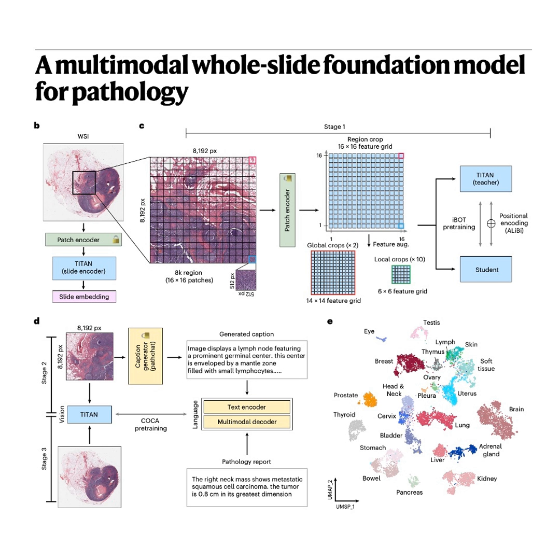And the end result of stage one is Titan V, a model that deeply understands histology's morphology and its spatial context. So quick recap then. Stage one gives us this general vision encoding using a vision transformer in the feature space trained on nearly 340,000 slides? That's right. But this brings us to the biggest technical headache: scale. If that feature grid is so enormous, how on earth do they handle the long context modeling?